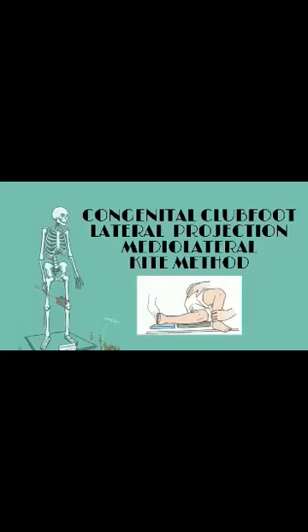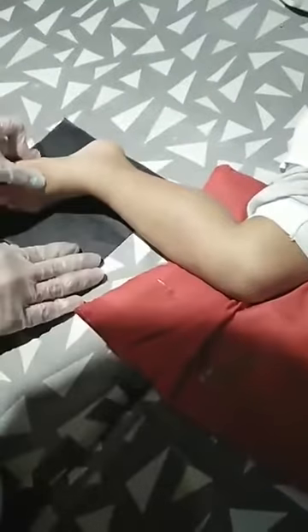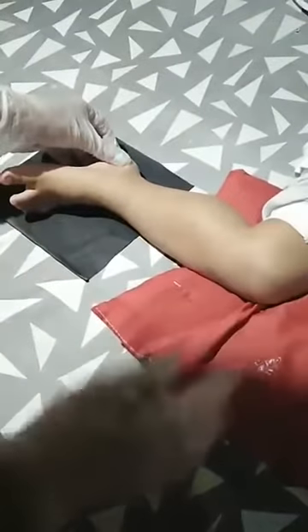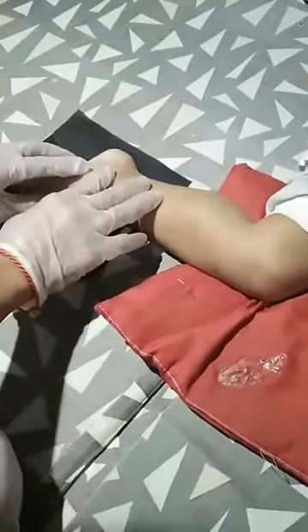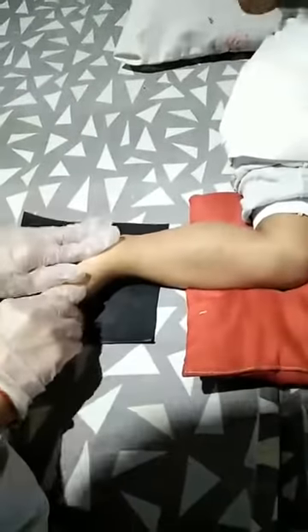Position of patient: place the infant on his or her side in as near the lateral position as possible. Flex the uppermost limb, draw it forward, and hold it in place. After adjusting the IR under the foot, place a support that has the same thickness as the IR under the infant's knee to prevent angulation of the foot and to ensure a lateral foot position. Hold the infant's toes in position with tape or a protected hand.